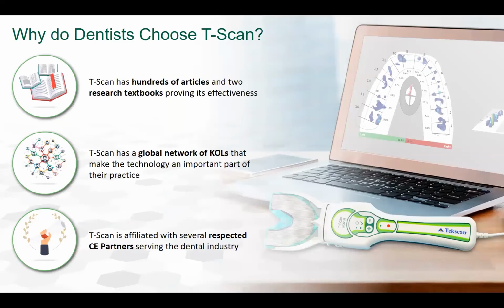So as you consider taking the next step to becoming a T-Scan dentist and making a decision as to which technologies to bring into your practice, it's important to understand the things that set T-Scan apart from other technologies that are on the market.